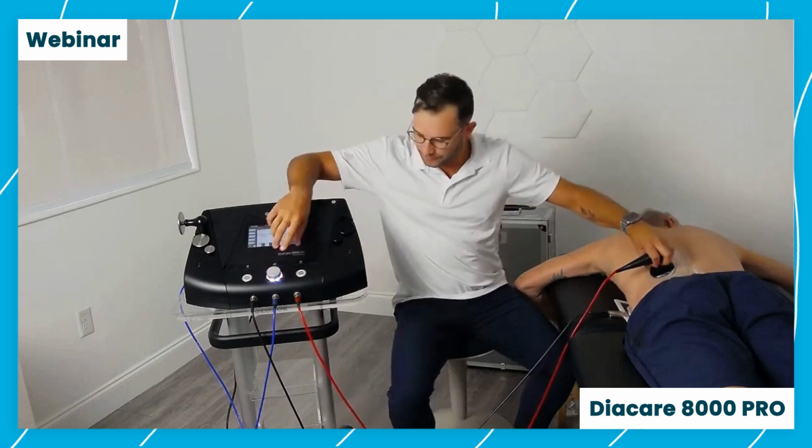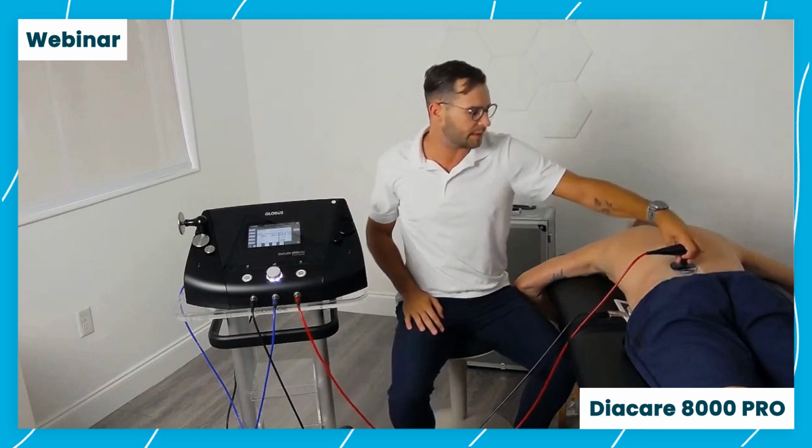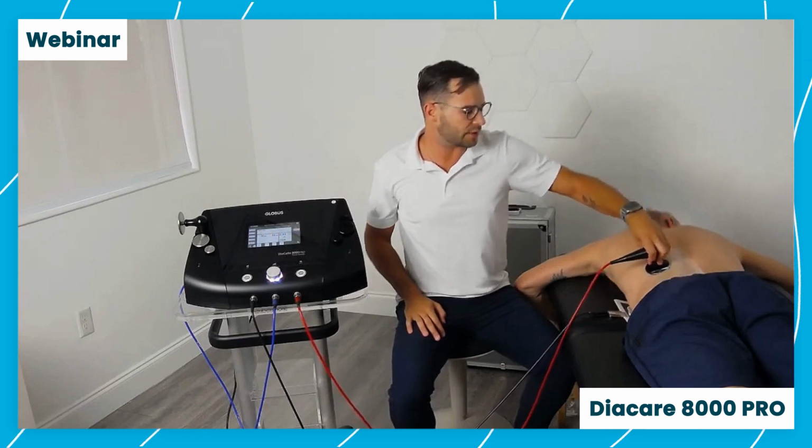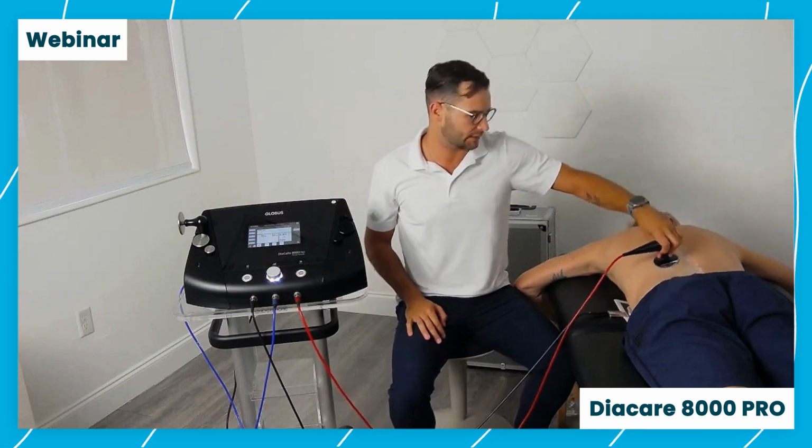We have a pretty low setting here, but we want to keep it moving anyway. You always want to keep the head of the electrode moving, as you don't want to generate too much heat in that area where the patient would be uncomfortable or it feels very, very hot.